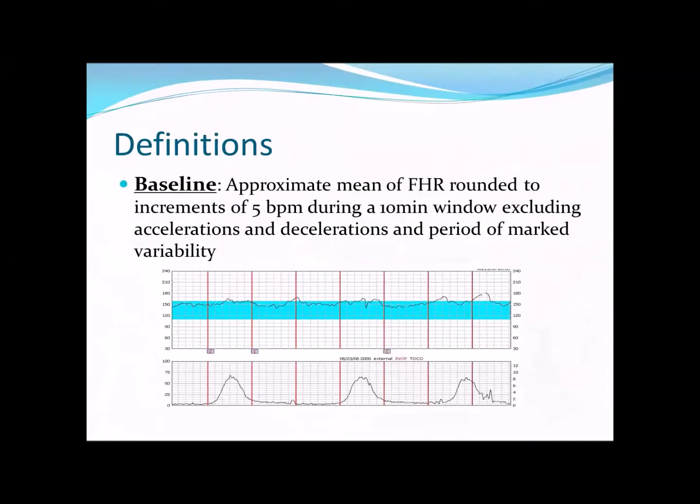So I already mentioned baseline. When we talk about baseline, it's kind of like the flat parts, which is funny because the fetal heart rate isn't really flat.